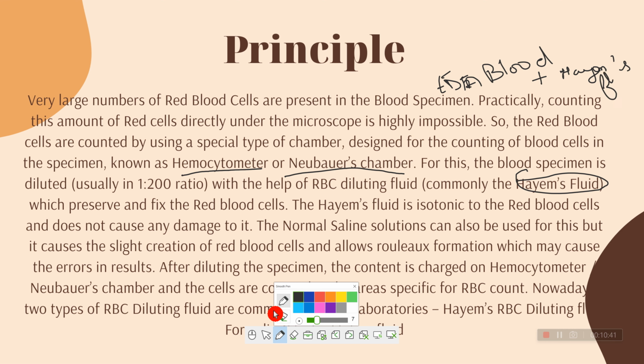Commercially prepared Hayem's fluid is available in the laboratory. We mix the EDTA blood with Hayem's fluid in the ratio of 1:200.